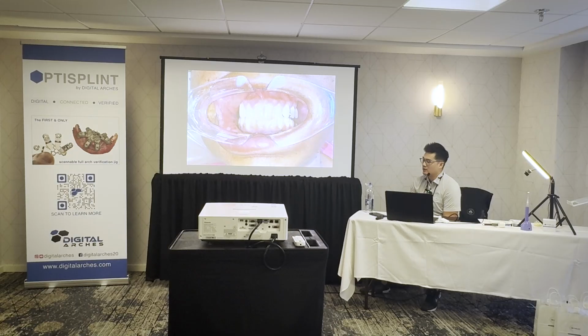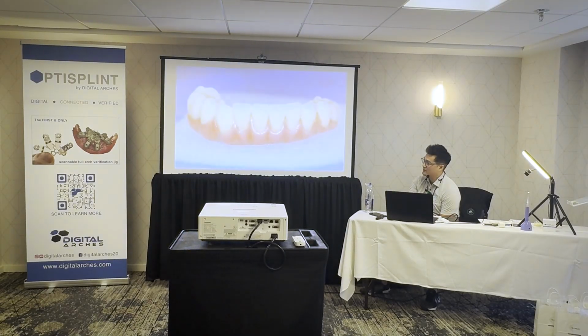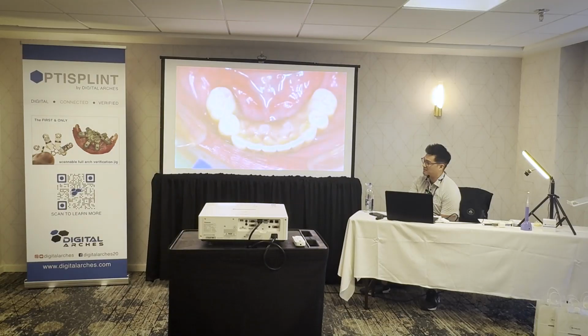So Pamela, I just showed you this. What happened was her dentist had to go on medical leave, and so the surgeon said, okay, well, I'll deliver the case. When we delivered this, we did no occlusal adjustments, none. All I did was take our same design and finish it in zirconia. There was no scan. Pamela came back, her temp held up well, and we just duplicated this in zirconia and delivered it.